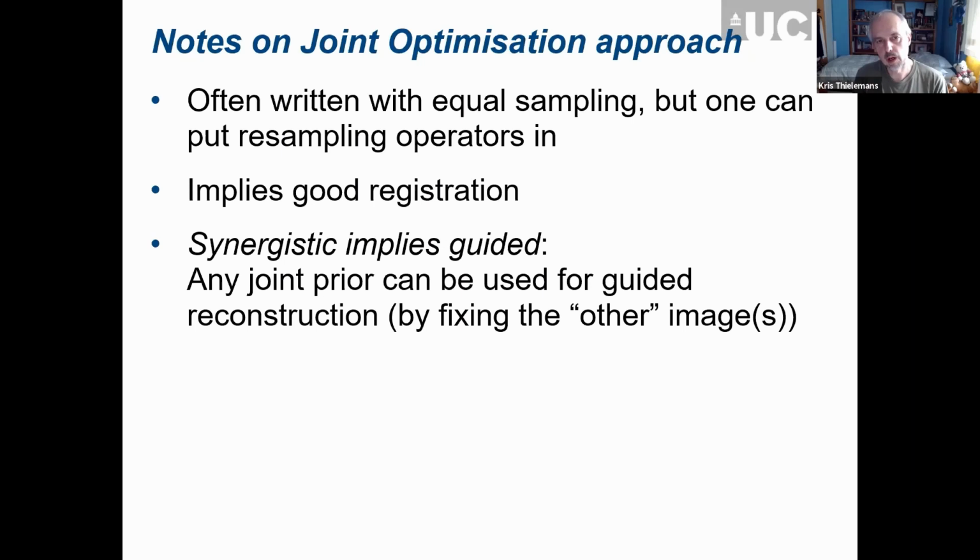Yeah, so that's certainly true. It's often easier to think about ill conditioning in terms of scale of the image. If you do a gradient descent type of algorithm and you just scale one image with a factor 100, it's going to change your gradient, right?